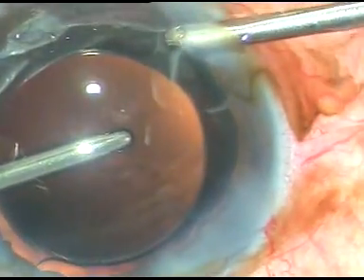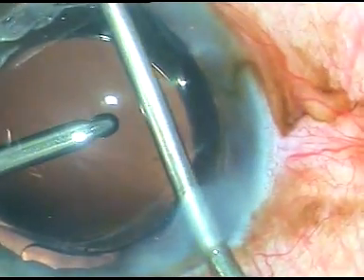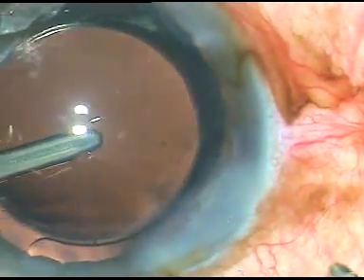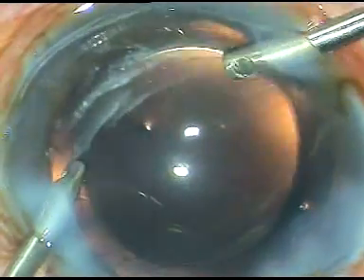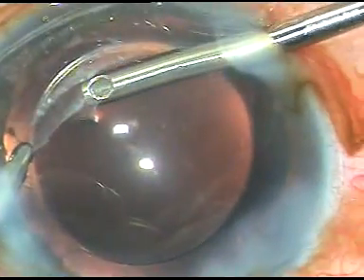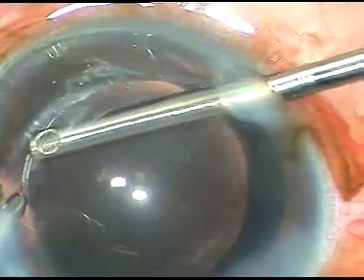I kept a vitrectomy cutter ready, so I have planned to remove that vitreous strand by trimming it with a vitrectomy cutter. Here it is. I'm trimming that vitreous strand, and I have nicely trimmed that vitreous strand.